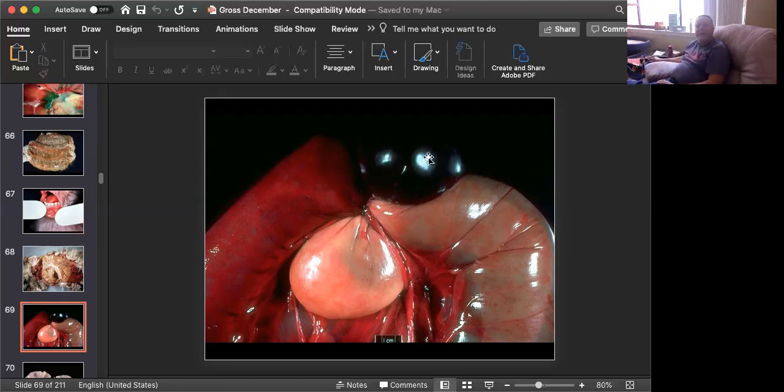So you get this bit of mesentery, which is wrapped around, doesn't affect the arteries. They continue to push blood in, but the veins can't move the blood on. So that's why venous infarctions are very dark purple. Arterial infarctions, if you get one of those, then the tissue becomes very white and blanched, but it's a classic venous infarction. Can we put the morphologic diagnosis all together here? This is a strangulating mesenteric lipoma with venous infarction of the intestine. A perfect morphologic diagnosis for a classic lesion.